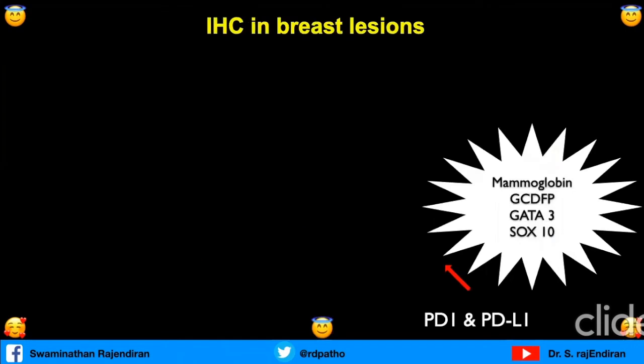In the breast lesions, immunohistochemistry, where it is used, first, there are some markers that are useless in breast. They are the breast specific markers: mammaglobin, gross cystic disease fluid protein, GATA3, SOX10. They are positive in breast cells in benign, hyperplastic, DCIS, as well as in invasive carcinoma.